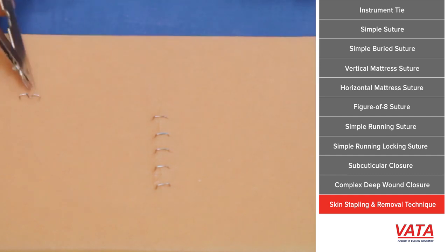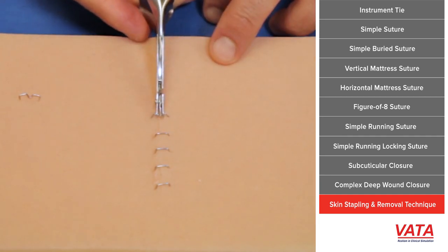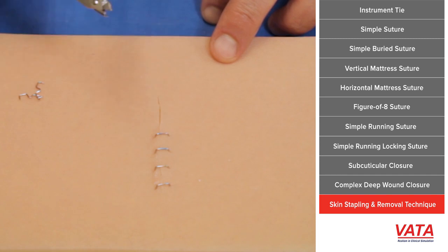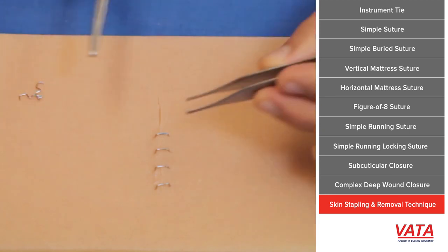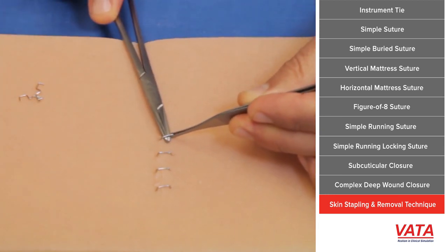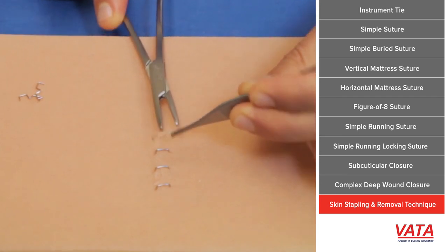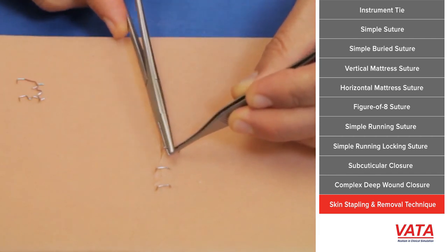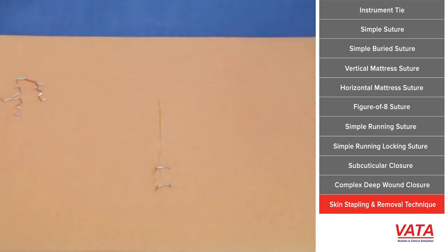If you don't have a staple remover, you can also use a needle driver or a clamp, place it under the staple and just spread — basically spreading does the same thing by straightening it out. This is much less painful for your patient if you can use the proper device, because it straightens everything out and simply pulls out with no pulling. Sometimes if the apparatus doesn't straighten them completely, you can rock it gently. With a needle driver, you just spread to open those tines and it'll come out. It's usually better to do this on a patient who's asleep because it can hurt to remove staples this way. Sometimes you need to rock from side to side if one side is not completely open.